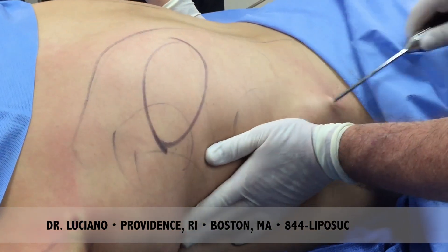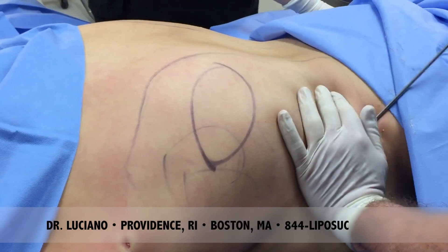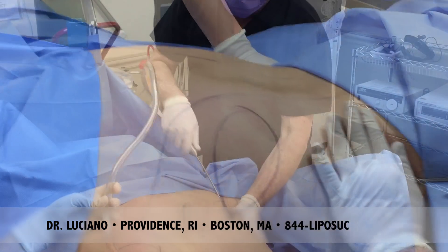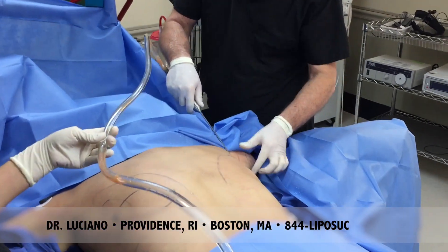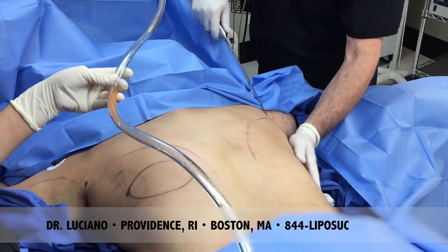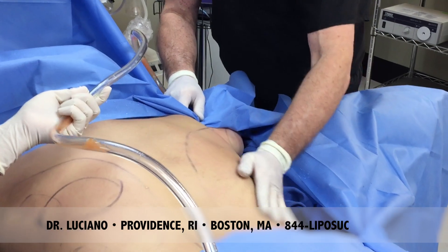Sculpting this area, taking the excess fat. Alright, now we did that side, now we're going to come to this side — the arm, the entire back, the love handles. See how the fat comes out nice and clean. So here it takes a little bit longer folks, but we love that sculpting.